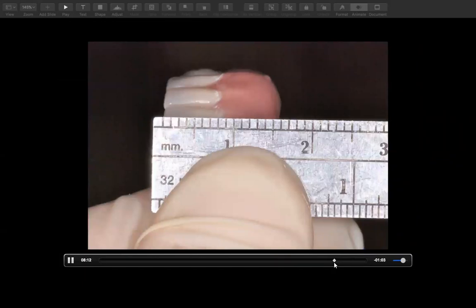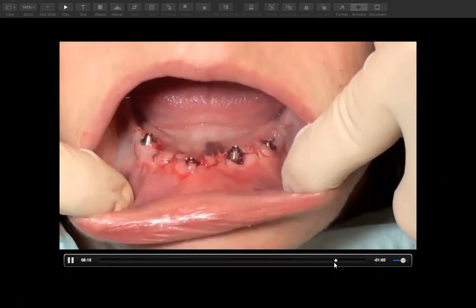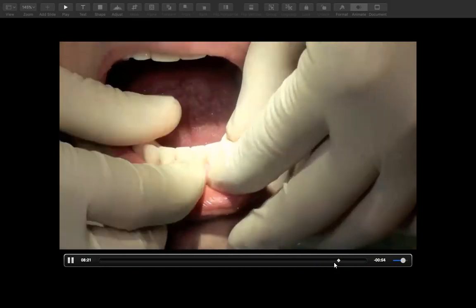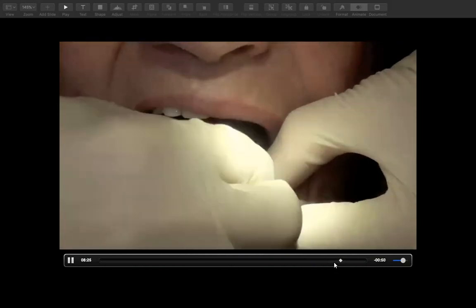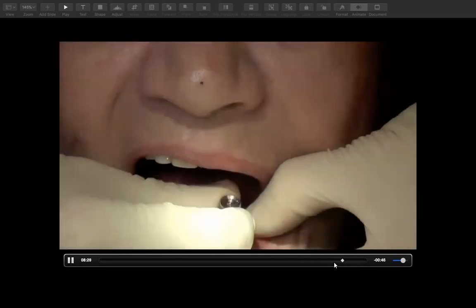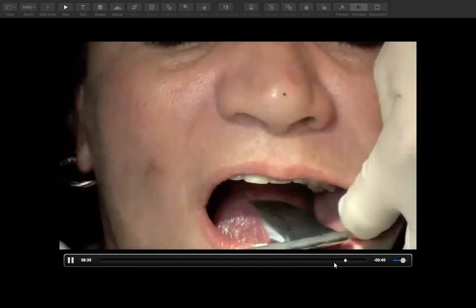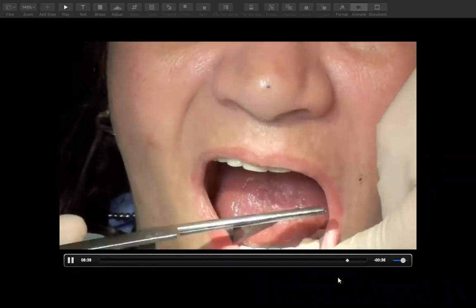I remember when we do these conversions, doctors are kind of waiting. The patient, you know, maybe the surgery took a while. Maybe the patient was under. Maybe there was an anesthesiologist there, put the patient out completely. And so sometimes they're in a hurry. They want to get these in and get the patient home. They've been in the chair for, you know, 3, 4, 5 hours sometimes. And so we want to get this done. You don't want to take your time. And so this is the conversion.